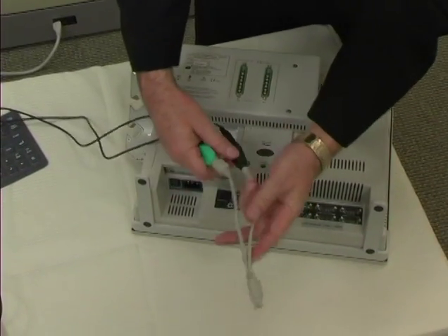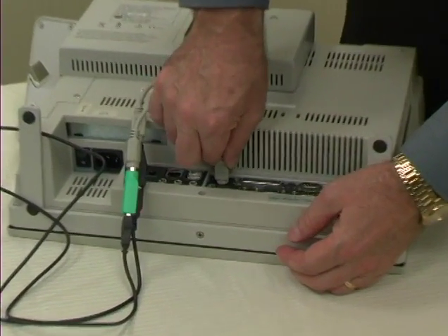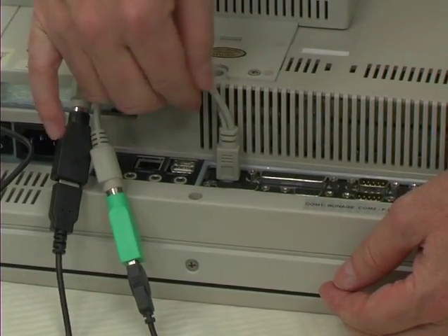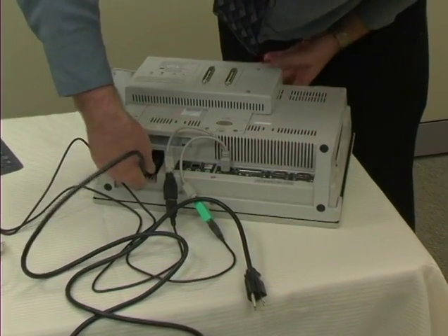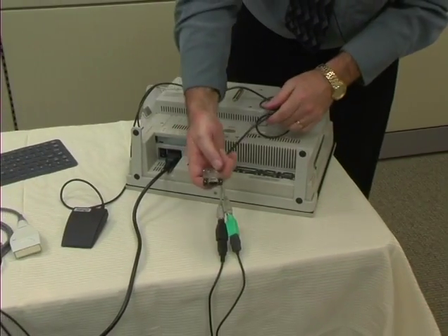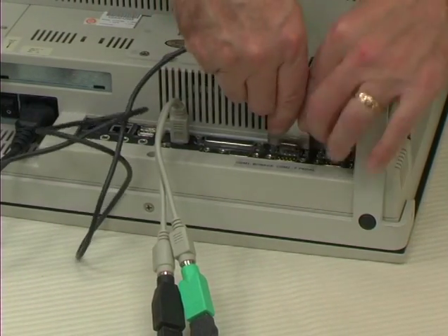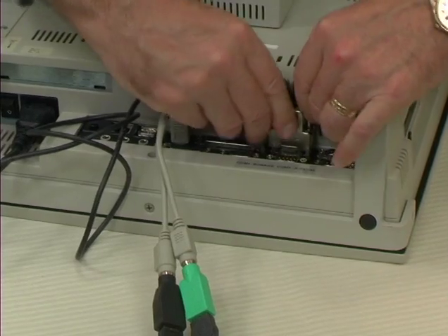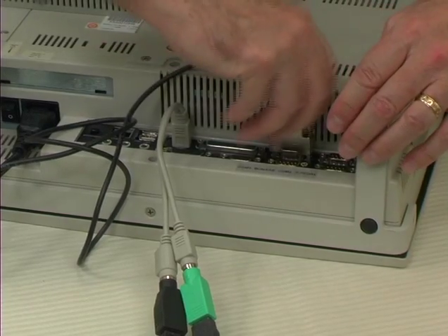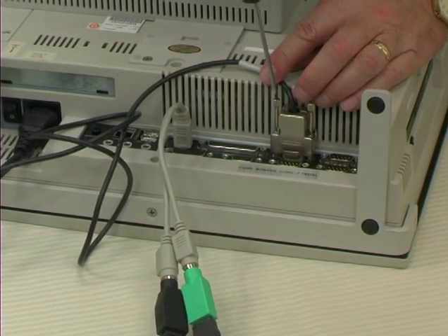We'll first attach the keyboard and mouse. We're going to take the end of the adapter and put it in the back of the unit in the receptacle marked KB/mouse. Then we'll attach the power cable to the unit and attach the foot cable to the unit. It's marked on the back of the unit that it should go in COM2, and we'll screw it in. There is a screwdriver supplied if you would like to screw it in more tightly.